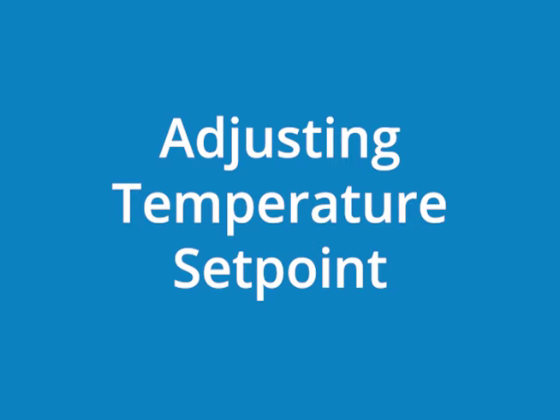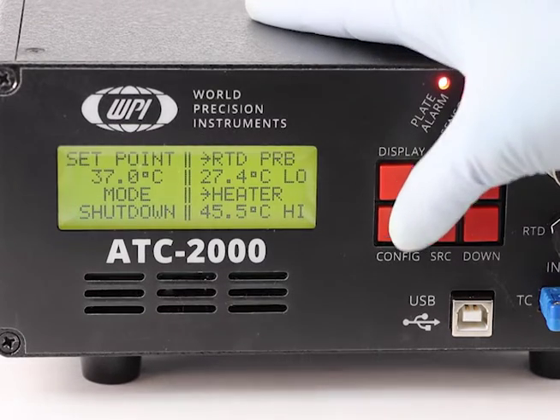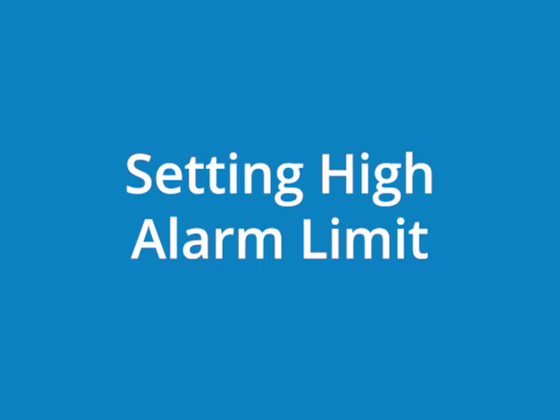Now you may adjust the temperature set point. The default setting is 37 degrees Celsius. The controlled temperature range can be adjusted to 45 degrees Celsius. You can toggle to the high alarm limit.